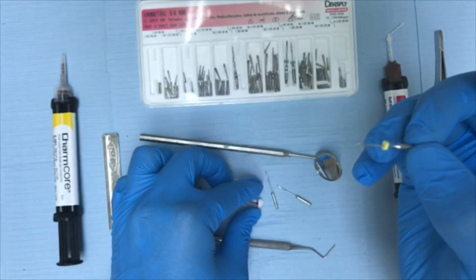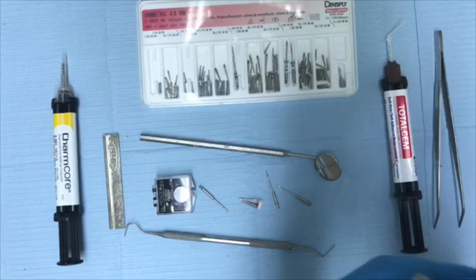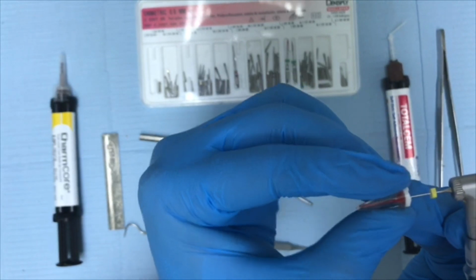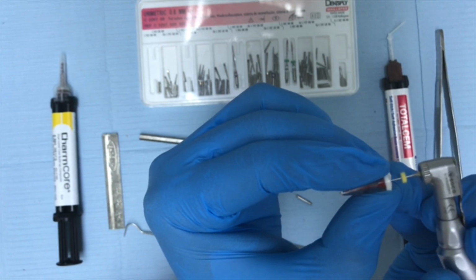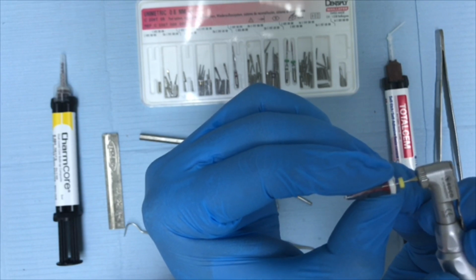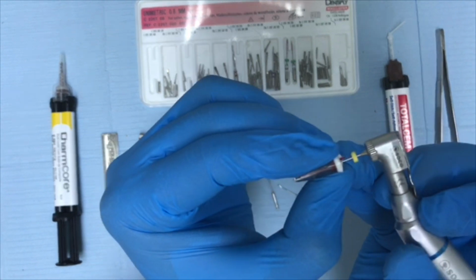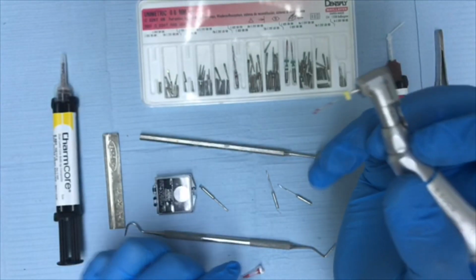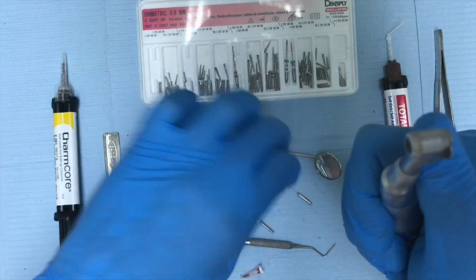Okay, and then attach the Gates Glidden into the low speed handpiece. Now cautiously introduce it into the root till the indicator reaches the reference point. We started with the smallest size, and then we go to the larger sizes.